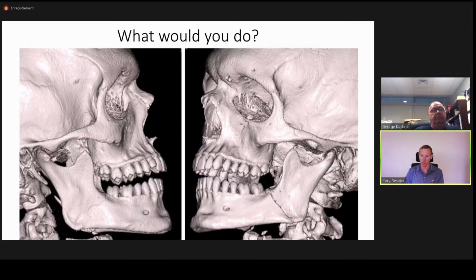You grab your wire and detach it, and then do the same thing a second time with the other end of that wire going on the facial surface of the mandible. And then you have your two wires extending into the mouth on either side of the mandible. And then, of course, you do that as many series of times as you need wires, and then just twist them down as you would any other fixation technique.